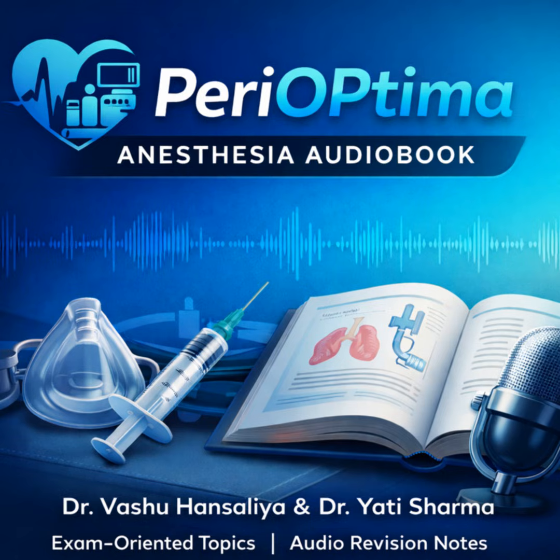We've arrived at the purely exam-focused section. Common exam questions and Viva traps. The tips to maximize your score. Okay, let's talk classic Viva questions. You will be asked to define laryngoscopy and to define a difficult airway using the precise ASA criteria. Which are? More than 3 attempts, taking more than 10 minutes, or the need to use an alternative device or adjunct. You have to know that definition.